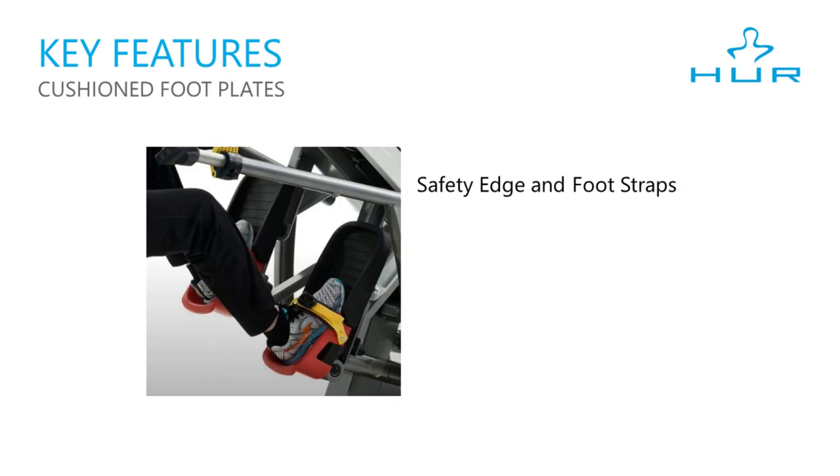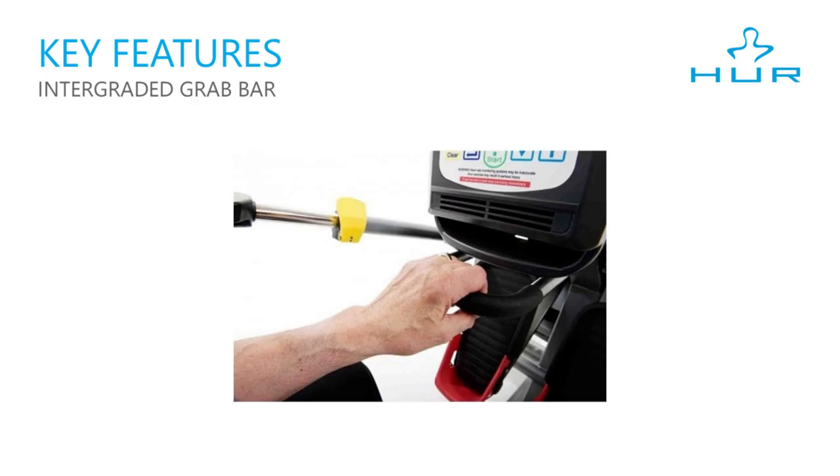The Step 1 comes with oversized orthopedic footbeds with a safety edge and heel cup to accommodate shoes of any size. The integrated foot straps provide security when needed and can easily be moved out of the way for standard use. The integrated grab bar provides an ergonomic location for hand placement to provide an easy way to get up and down from the seat.